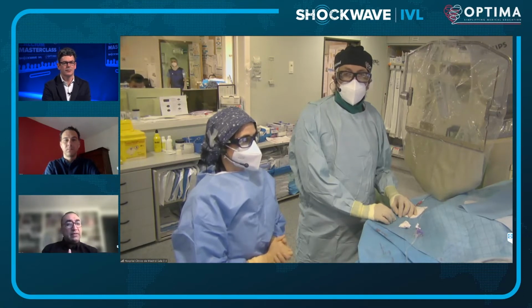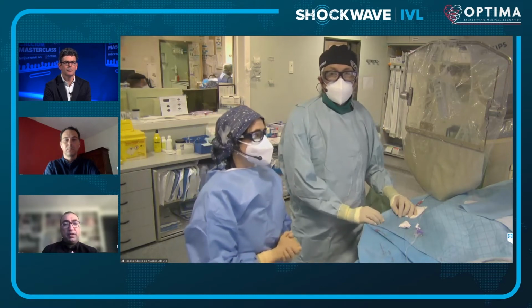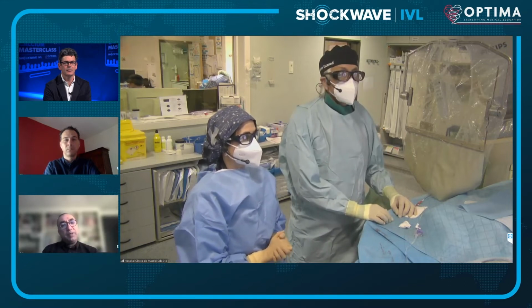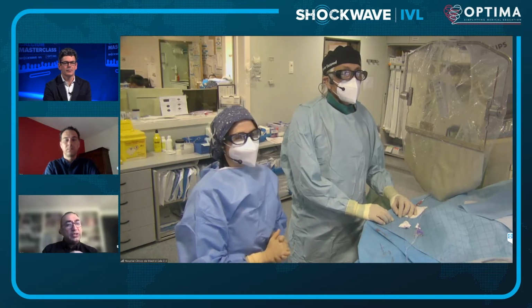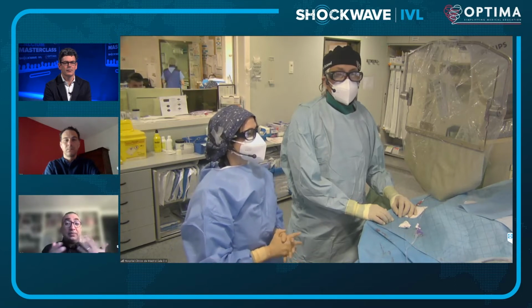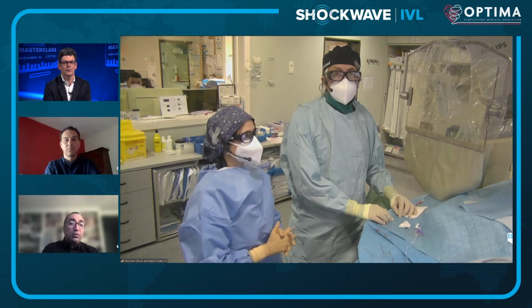We do also have CSI here in the United States. I know it's just become available in Europe too. You could CSI this lesion as well. It's a little bit on a curve, but I think if I was going to use atherectomy, I'd probably be using rotational atherectomy. If I look at my practice right now, I would say this might be a case where I would do atherectomy followed by shockwave.